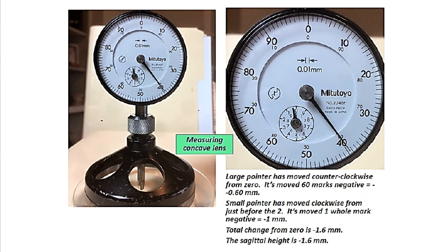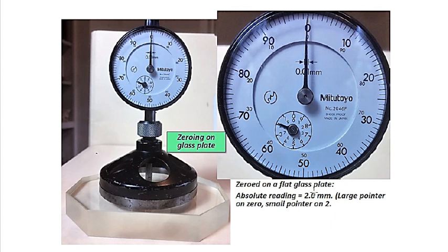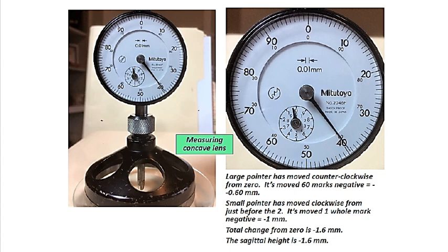So it went from here to about 1 millimeter. We're assuming that we use the same 0, which is your starting point, because we're using the same glass plate anyway. So you're going to get 1. Since we're dealing with a concave lens, it's going to be -1, and we went from 0 all the way to about 60, so therefore that's minus 1.60 millimeters.